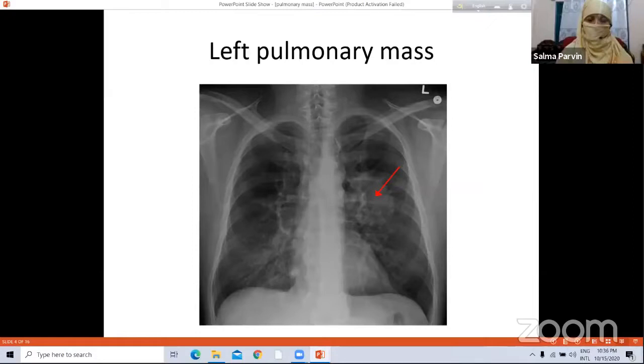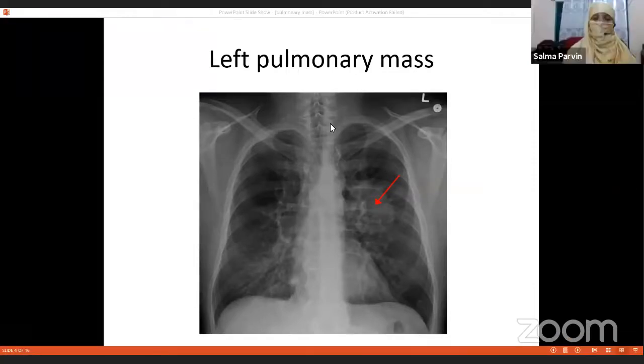Sometimes we see, and what the lesion proper there is. So the density of the lesion is a part. You may not get a very high density lesion in malignancy. Rather, you may have such a medium density lesion. You see, we have said before that whenever you declare the patient has a proper position, here this patient has got proper position.